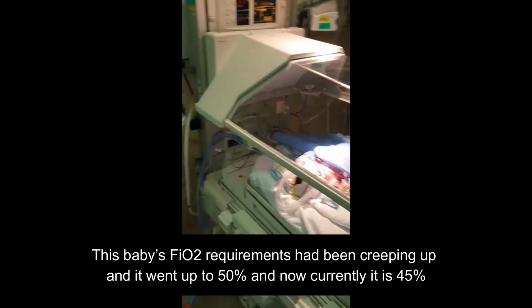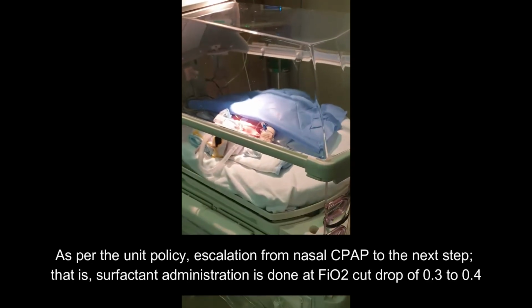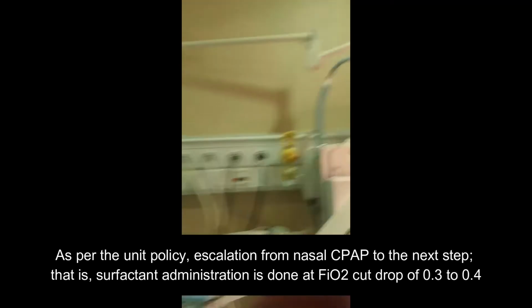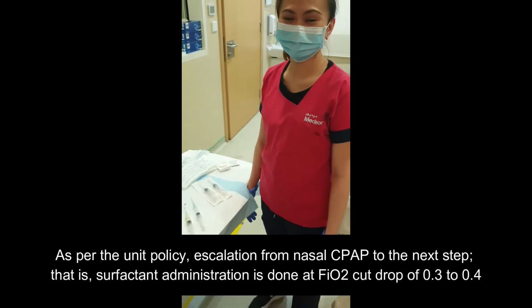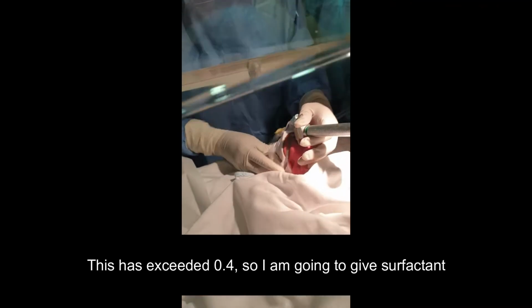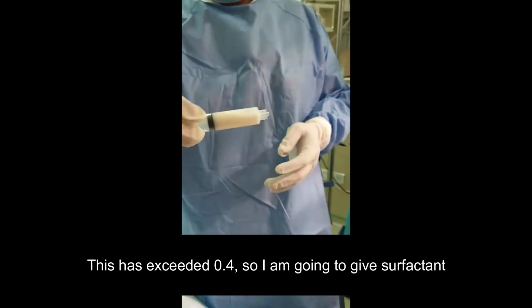This baby's FiO2 requirements whilst on CPAP had been creeping up and it went up to 50%, and now currently it is 45%. As per the unit policy, escalation from nasal CPAP support to the next step, that is surfactant administration, is done at an FiO2, fractional inspiration of oxygen, cut off of 0.3 to 0.4, in other words 30% to 40%. In this baby we have oxygen requirement which has exceeded 40% or 0.4, so I am going to give surfactant.